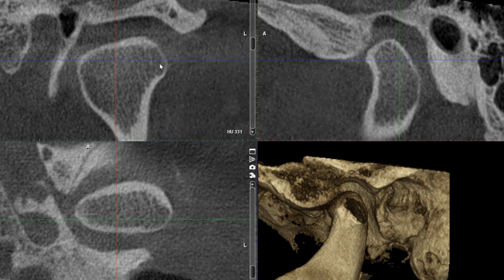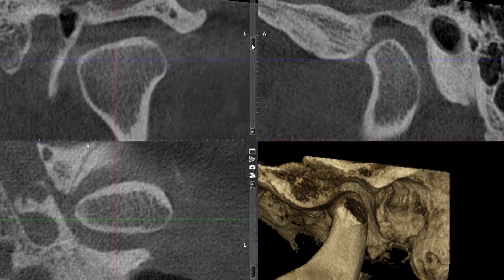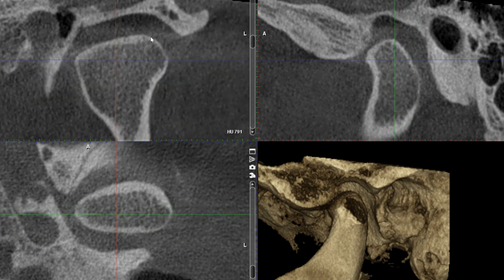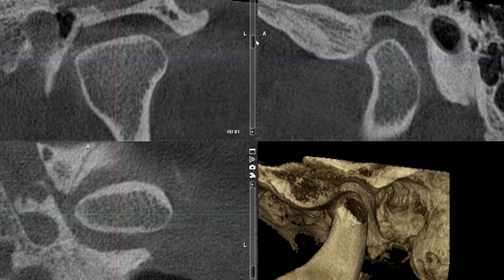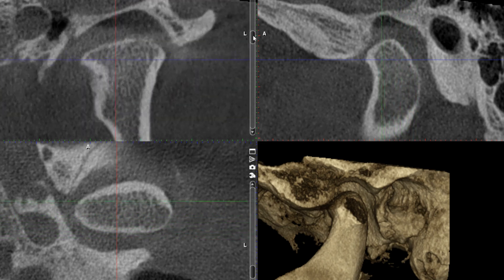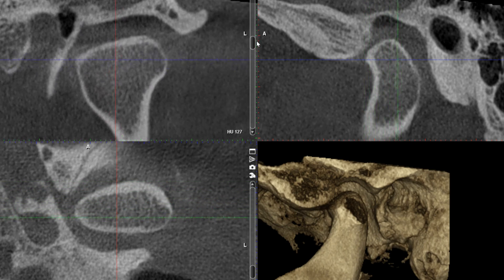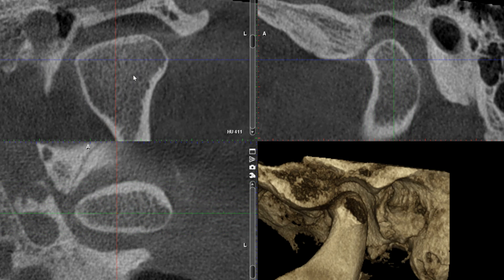Let's look at this coronal view. What I've done is rotated the condyle so that we're looking at the facial or coronal view of the patient's left condyle. A beautiful continuous and intact cortication of the left condyle can be seen. Here's the glenoid fossa, the interarticular joint space, and then the trabecular details of the trabecular pattern captured in the scan.